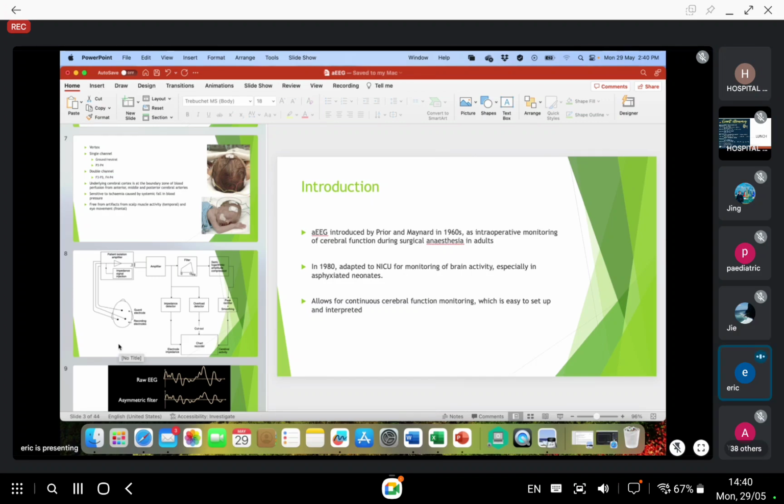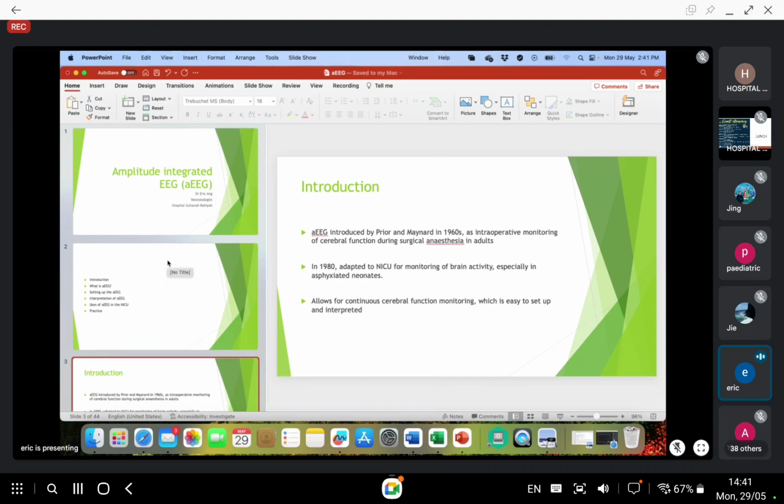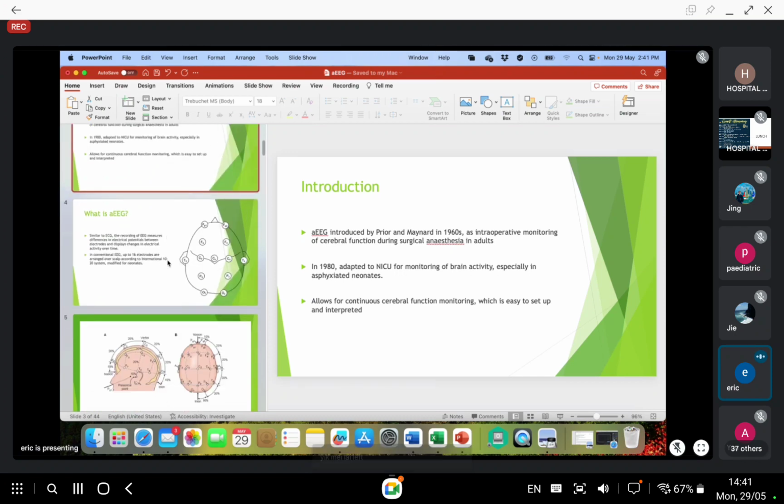So this is a CFM. I understand in some places they get the MA to do it, or the nurses are the ones doing it, right? For us, it has traditionally been the MOs doing it because we were using needles before. And we don't have a specific MA who is familiar with this device. Only now that we have Dr. Tan Ken An with us, we have a PITS Neuro MA, which deals with the EEG machine and not the CFM. So our MOs are still doing it.